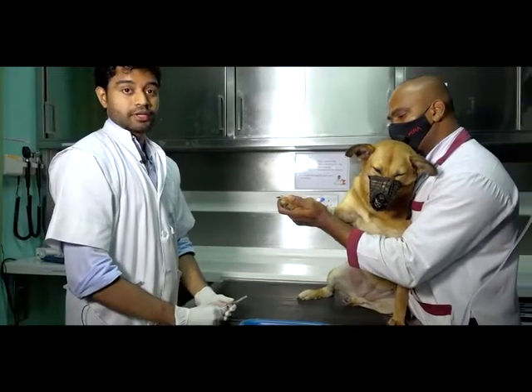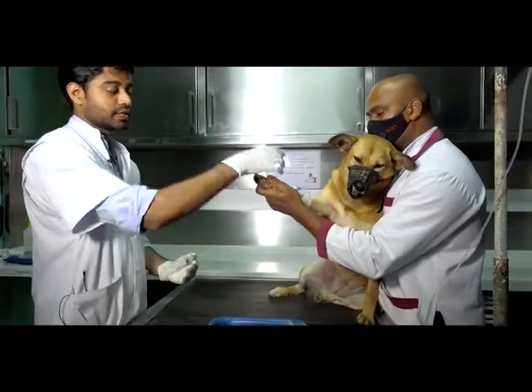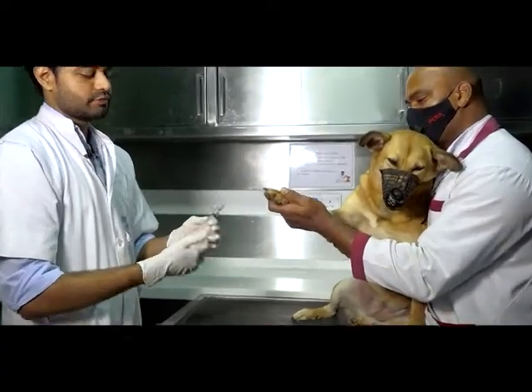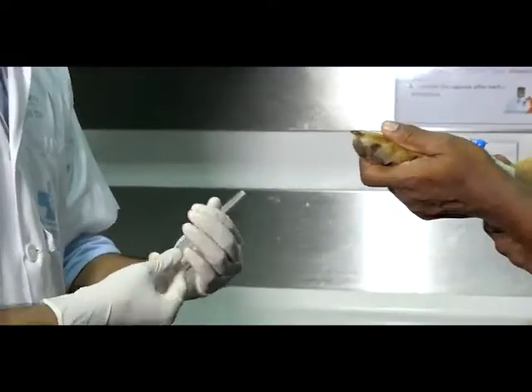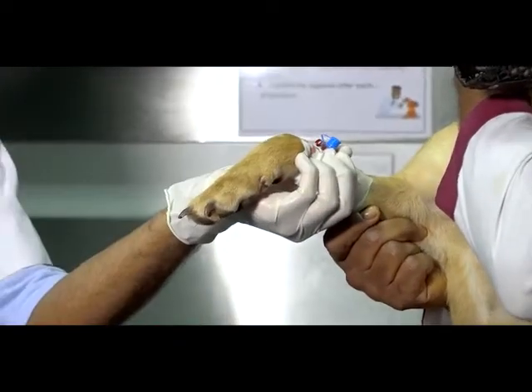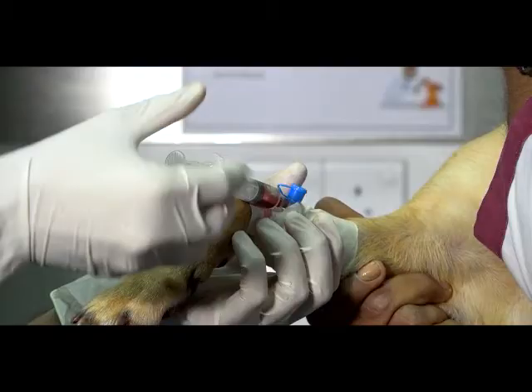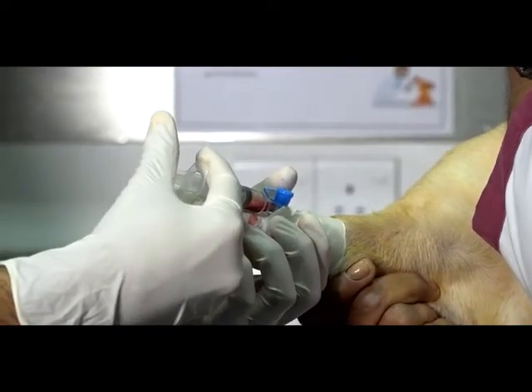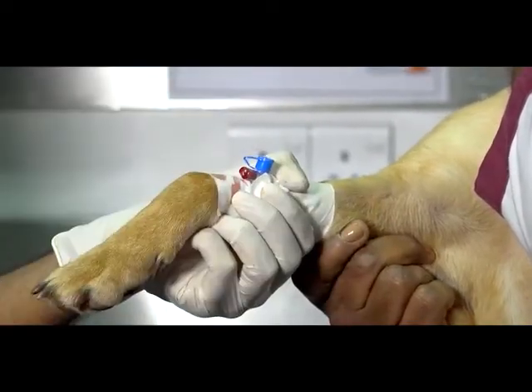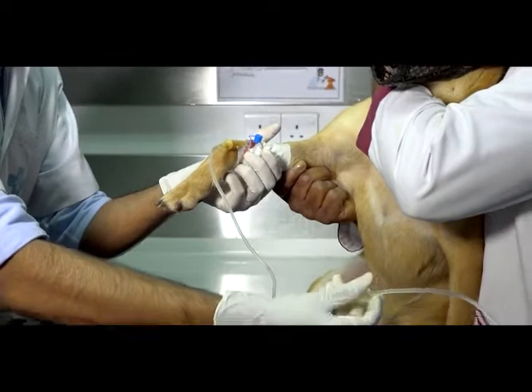So now we're going to flush a cannula. That is something you do before connecting an infusion set into a cannula that is already placed. For that we will need a syringe, preferably a 5cc or 5 ml syringe with about 1 to 2 ml of saline. And then you remove the needle like this, and take the cap off, and then you place it here and you suck out any clots that are inside the cannula. So since there are no clots, you can always infuse it in. So now we know the path is quite clear. And then we remove the syringe, place the cannula, the infusion set, and open our drip set.